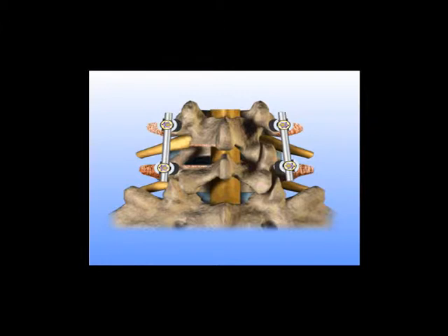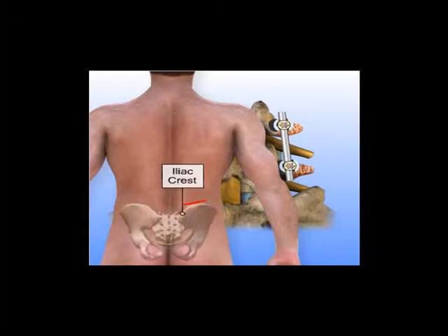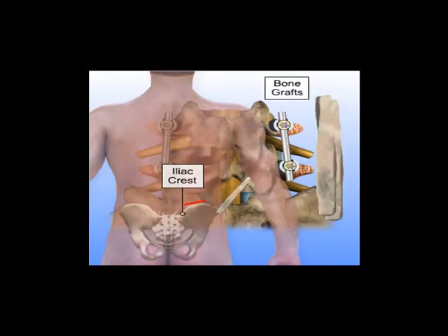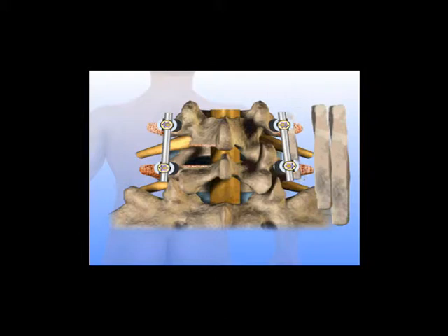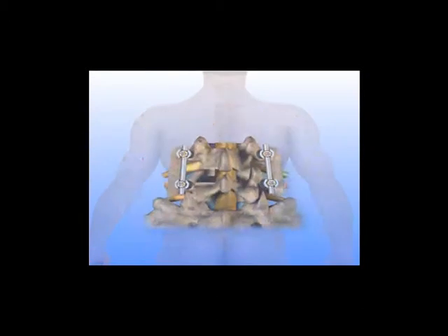The incisions are closed and dressed to complete the procedure. Adding the instrumentation with bone graft fusion increases the strength of the spine directly after surgery and may decrease the need for a post-operative brace. Patients often remain in the hospital for 2 to 4 days following the procedure and should avoid heavy lifting, bending, twisting, and turning for 6 to 12 weeks.